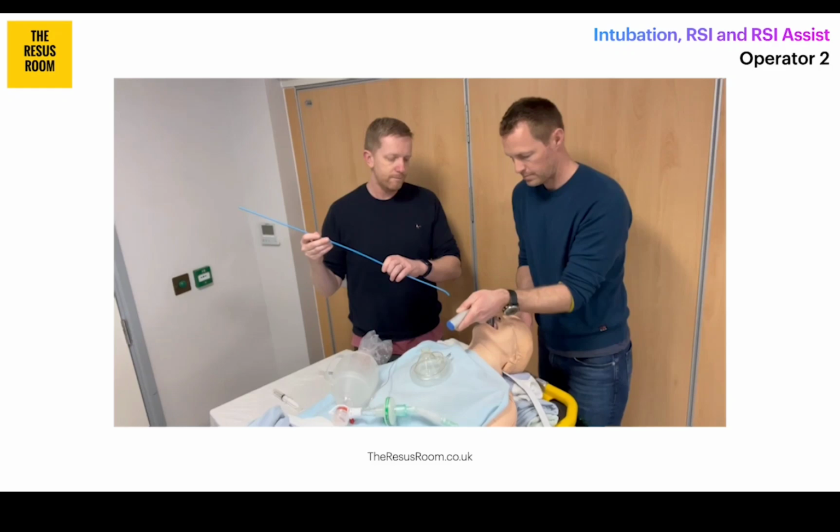offer his wisdom. Now, clearly this is where the benefit of video laryngoscopy really lies, because as well as having the problems described and watching my technique, he's also able to watch the screen and see the airway for himself. That means he can be getting ready to offer ELM or head lift or suction or whatever is required to achieve a successful laryngoscopy, and I've not even asked for it yet.